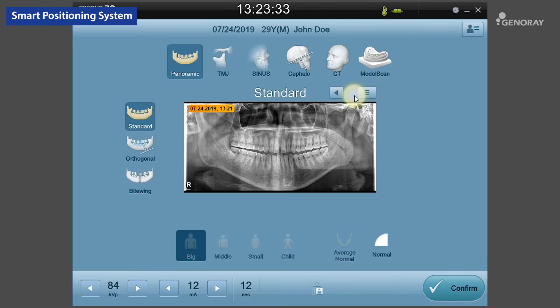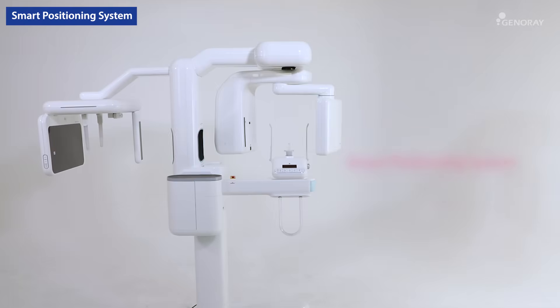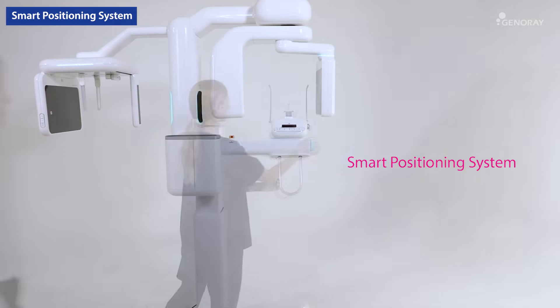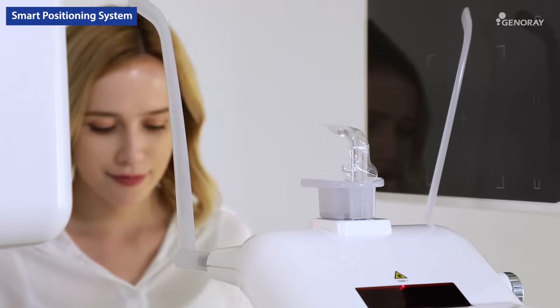New smart function. Take advantage of the SPS, the smart positioning system, in case of a revisit patient. By creating a database based on the exposure conditions and positioning of the previous images, you can create fast and convenient scans without any additional adjustments.